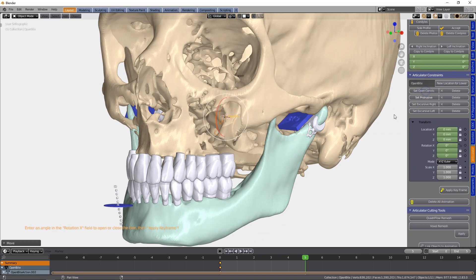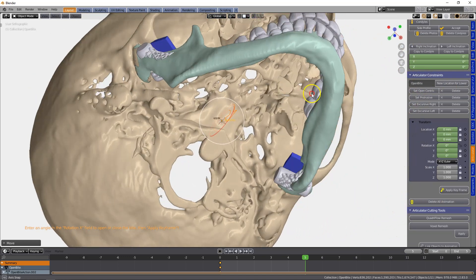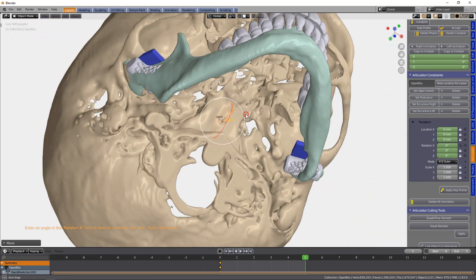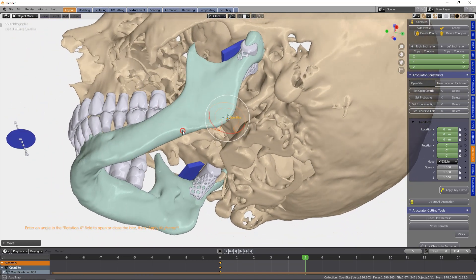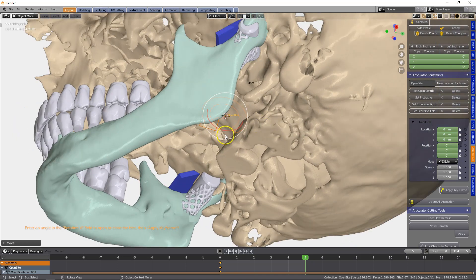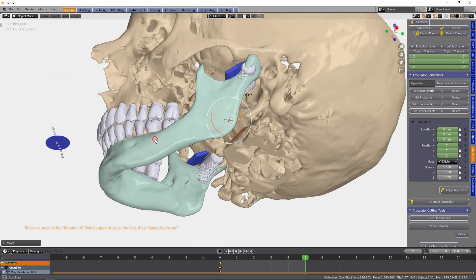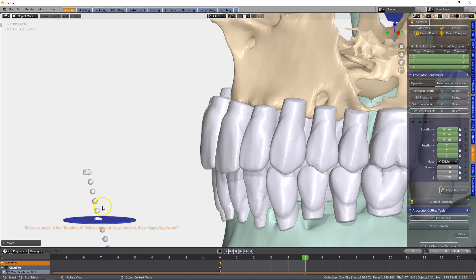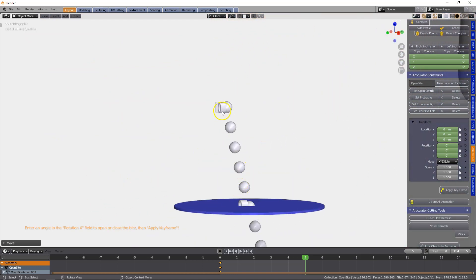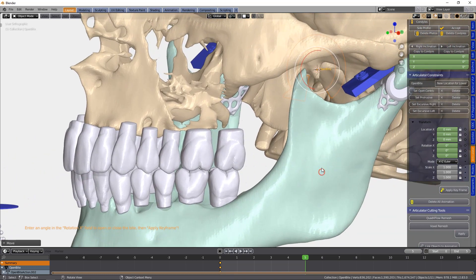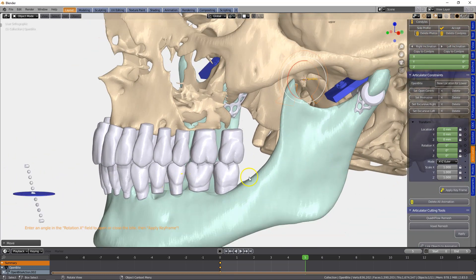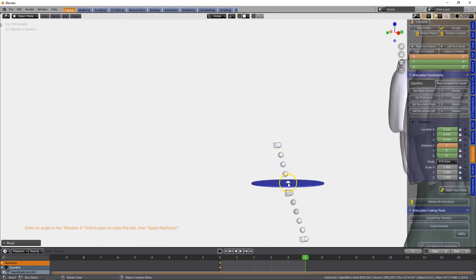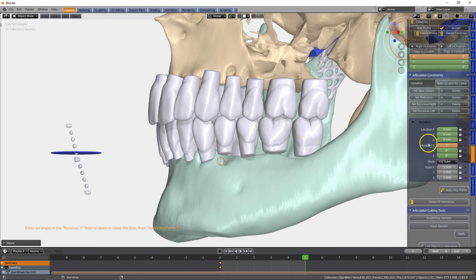Next we're going to move to the constraints and set the open — we're going to open up the bit. Everything with the articulator follows these arrow objects. This is the opening, and we have an incisal pin like on a physical articulator. When we adjust the jaw by one degree, the incisal pin will open by two millimeters. These spheres are all two millimeters apart.